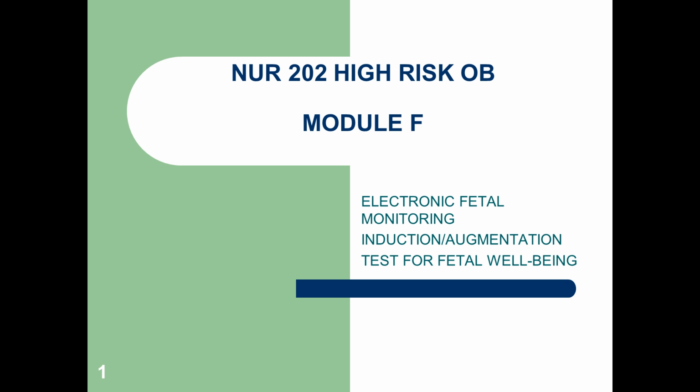The goal of fetal evaluation with electronic fetal monitoring in late pregnancy is to determine whether the intrauterine environment continues to be supportive of the fetus. So in other words, we're monitoring to make sure that the environment inside the uterus is still conducive to this baby's well-being, okay?